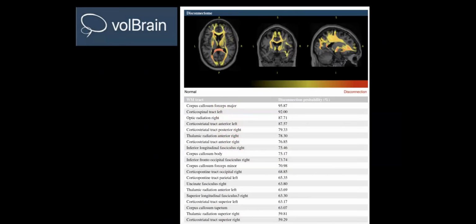We can also look at something called the disconnectome. So again, even though it's important to know about white matter microstructure, which is what the DTI gives us, we can also look at FLAIR imaging, and we can ask the question, are there lesions that can give us insights into areas of the brain that are disconnected? And the answer is yes, we can. And the reason that's important is because we can identify parts of the brain that are disconnected based on the disruption in white matter tracts.